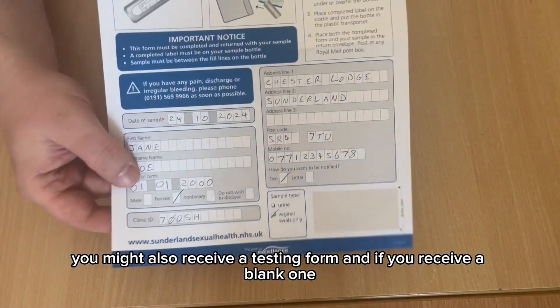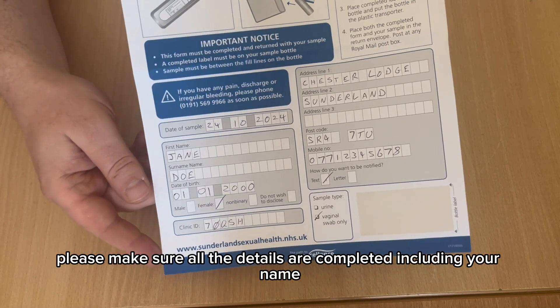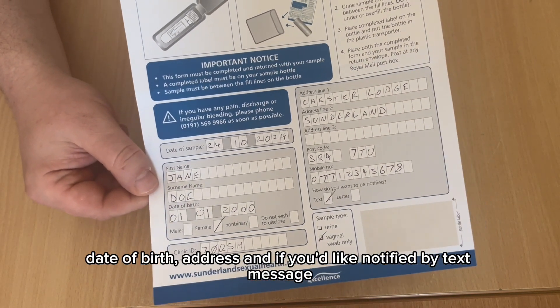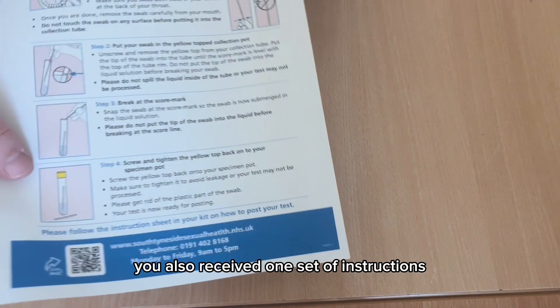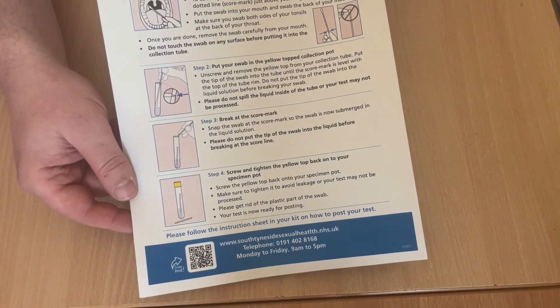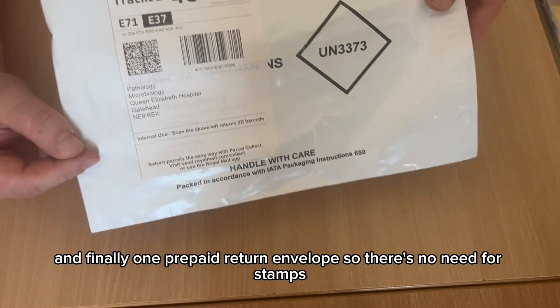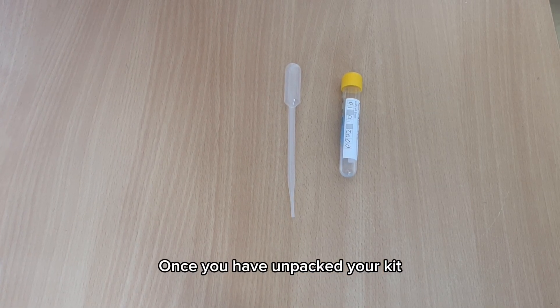You might also receive a testing form. If you receive a blank one, please make sure all your details are completed, including your name, date of birth, address, and if you'd like to be notified by text message, your full mobile number. You'll also receive one set of instructions and one prepaid return envelope, so there's no need for stamps.